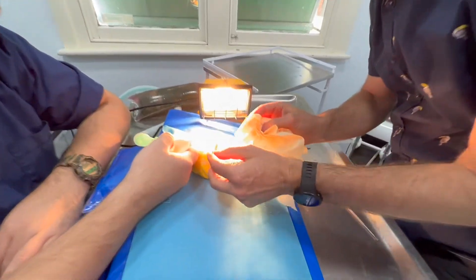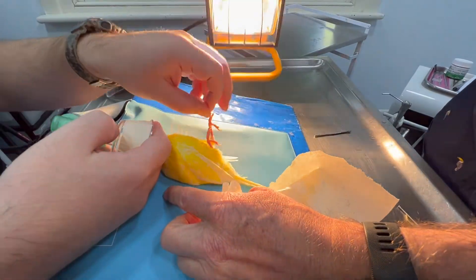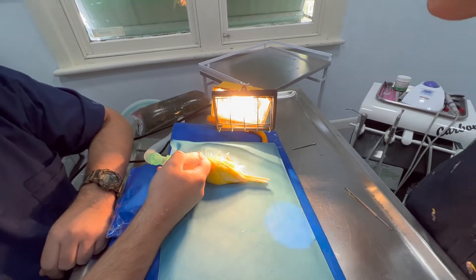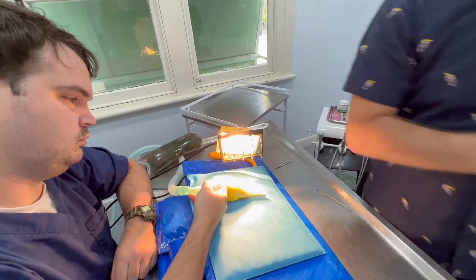What you can see here is a radiant heat source. The big thing when you do anesthetics in birds is keeping them warm. There's a heat mat and we've also got a heater in this room, and the bird's going to go into a heated incubator now.